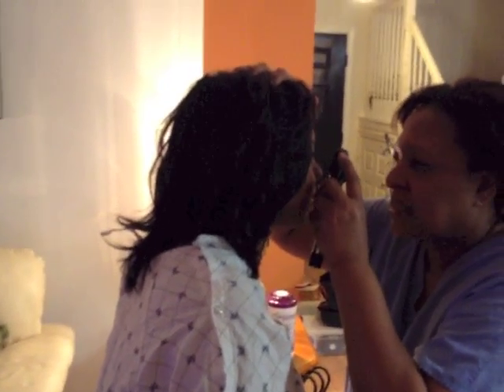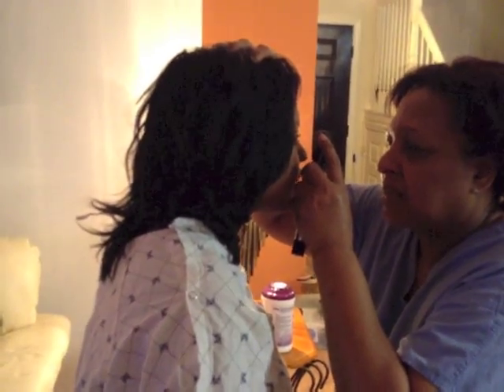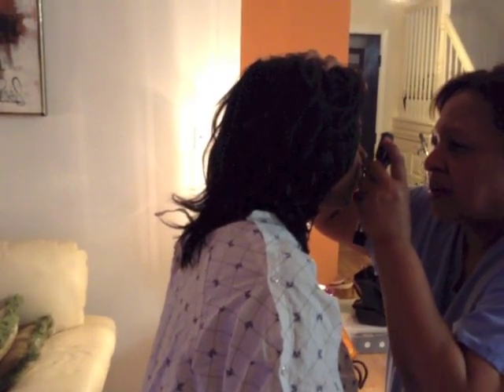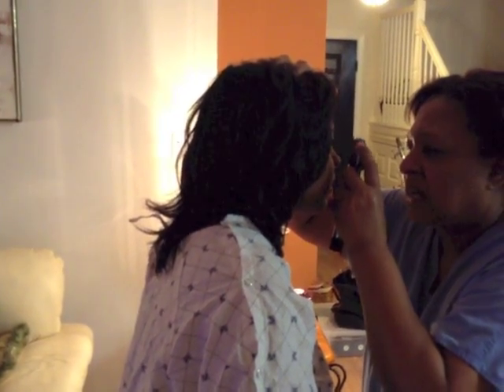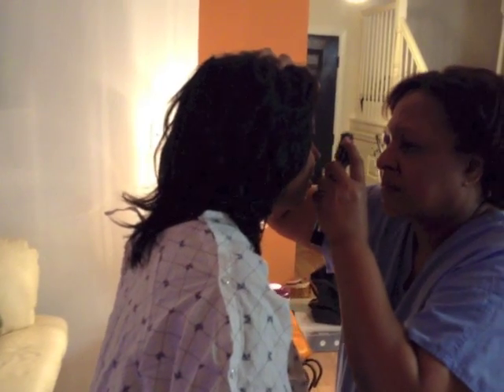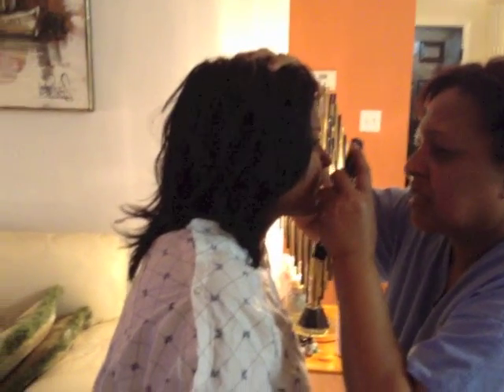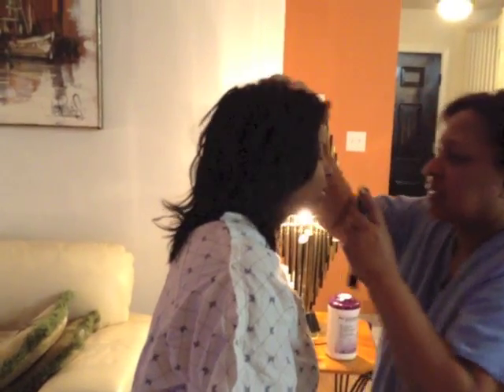I can see your malleus. I'm sorry, not the malleus. And inspecting your optic disc, the nerves. They got artery and the nerves coming together. And the physiological cup. I can see the retinal vessels. Very good. And I can see the fundus. And the macula, which should be on the right-hand side of your nose. Looks good. Okay.